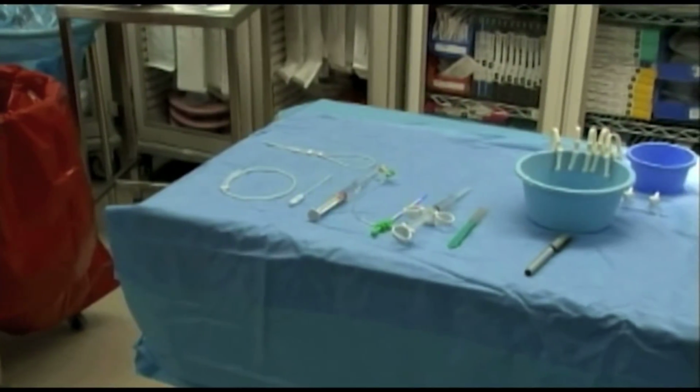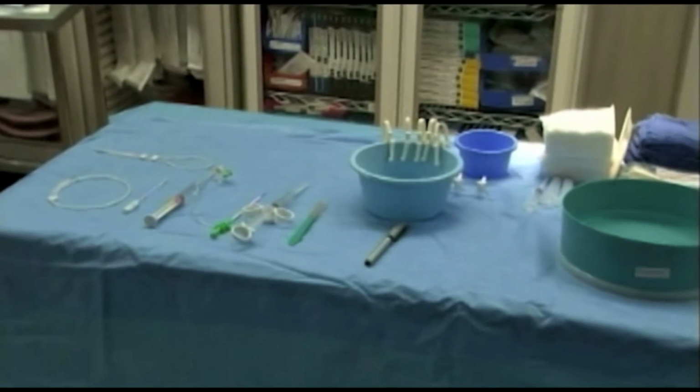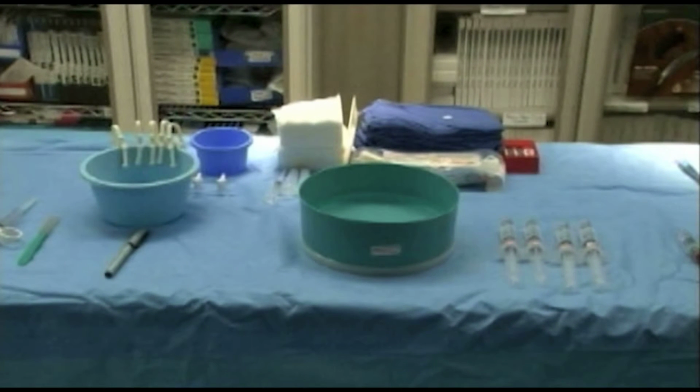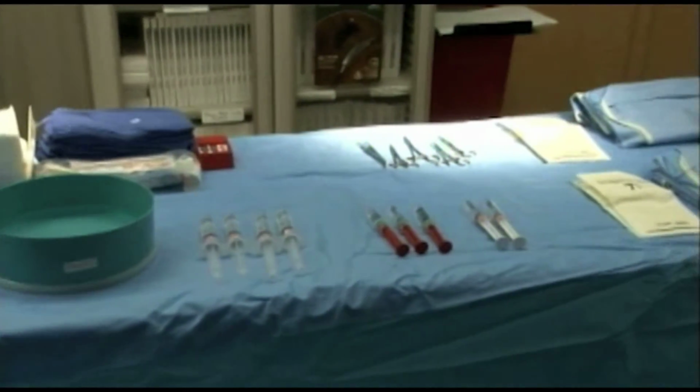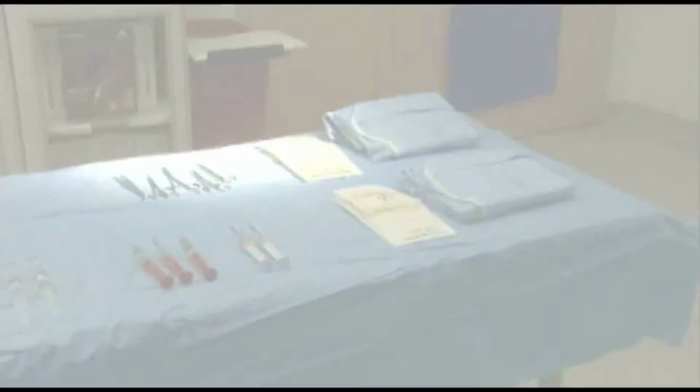On the second table, we have a 4 French micropuncture access kit, an 11 blade to make a small access incision, a 6 French sheath, and a syringe of lidocaine, bupivacaine, and bicarb. In the middle, we have a bowl for our wires and sterile towels. To the right, we have gowns, gloves, contrast, and heparinized saline.